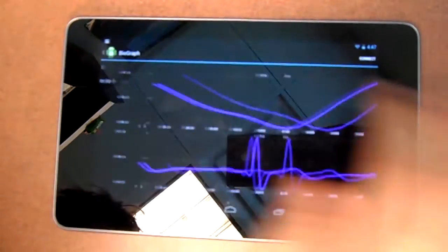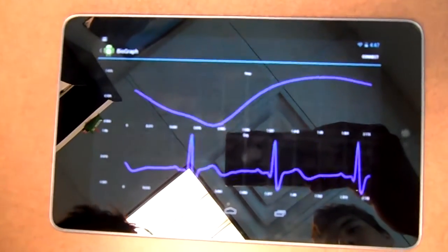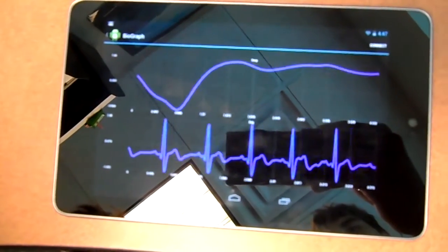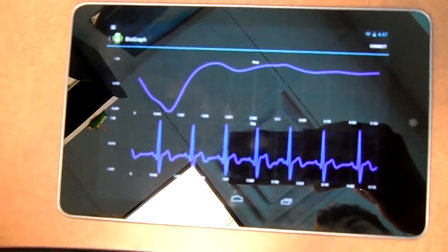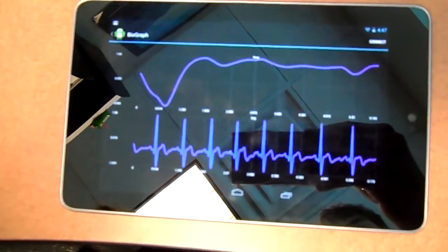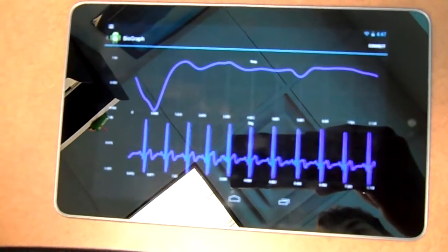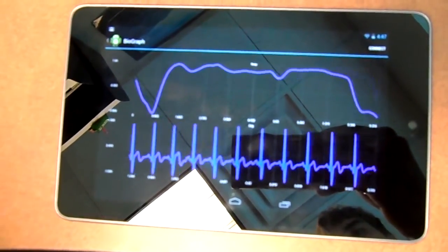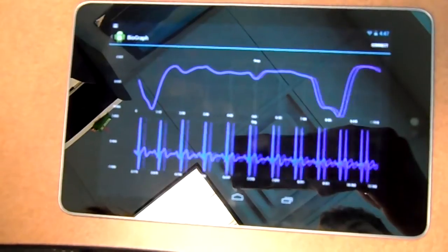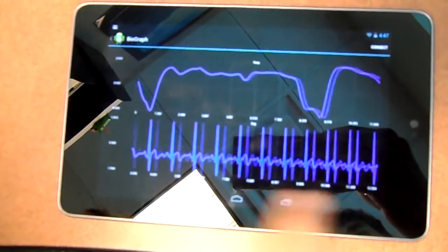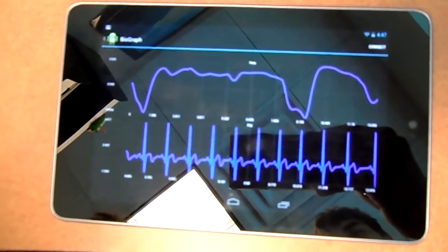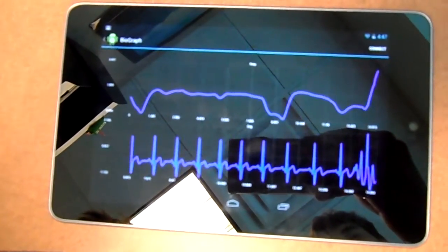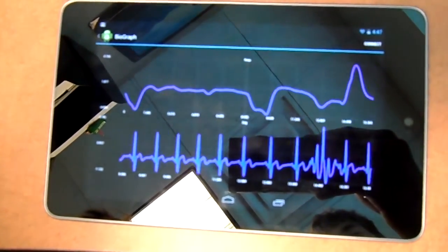As you can see there at the beginning, the data fills in until the buffer fills up with information. Afterwards, you're just going to see the data scrolling across like so.